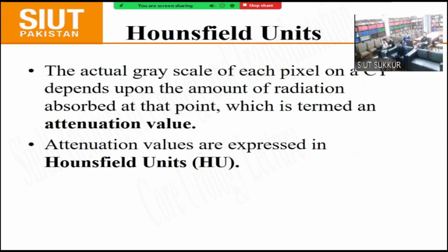So what are Hounsfield units? The grayscale of each pixel on a CT depends upon the amount of radiation absorbed at that point, which is termed the attenuation value. The attenuation values are expressed in Hounsfield units.